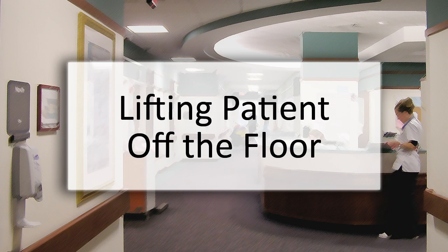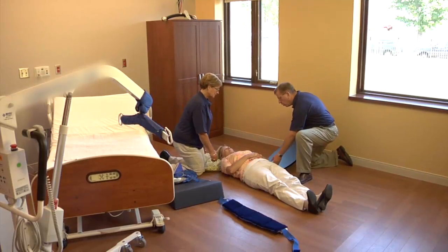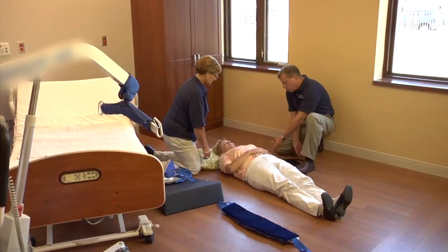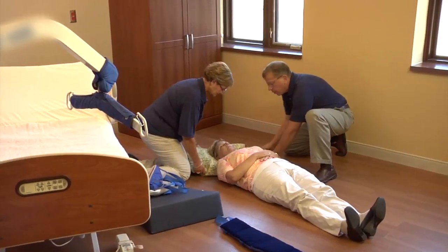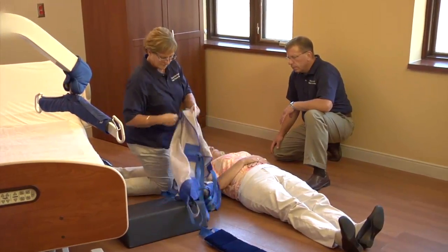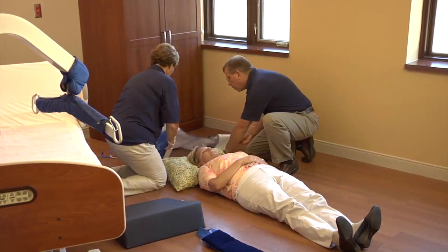In this video clip, we're going to take a look at a common occurrence in hospitals, home care, and nursing homes. When a patient falls, we all want to quickly have that patient off the floor, and many times we make a poor decision by manually lifting. We noticed often that when a patient falls, there are numerous people available on scene, and it's very important to take charge and have a leader start to point out how we're going to move this patient off the floor.